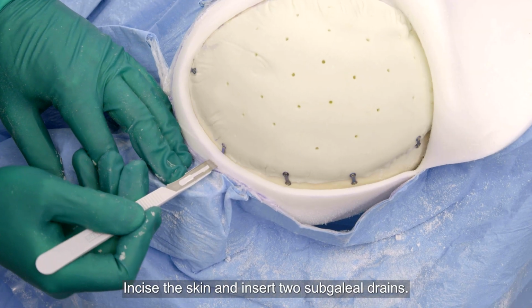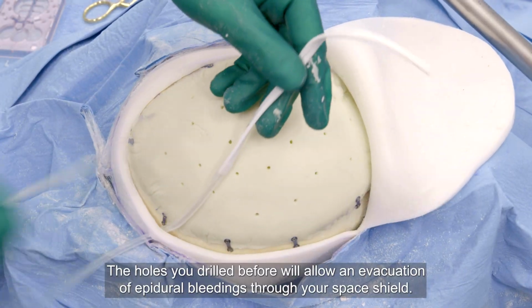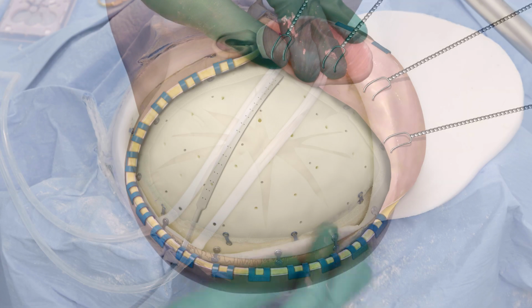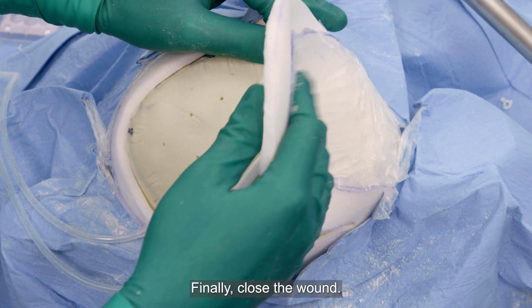Incise the skin and insert 2 subgaleal drains. The holes you drilled before will allow an evacuation of epidural bleedings through your space shield. Finally, close the wound.